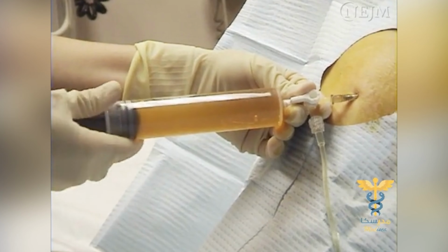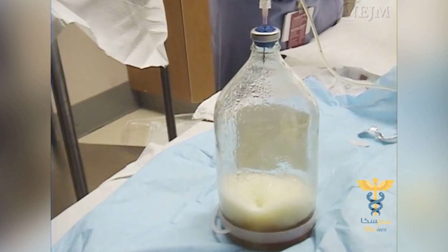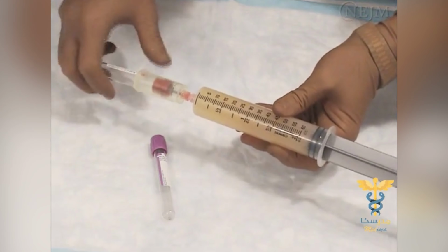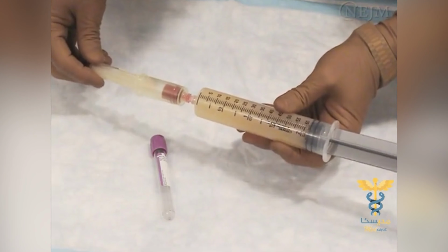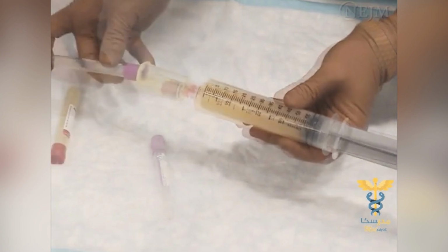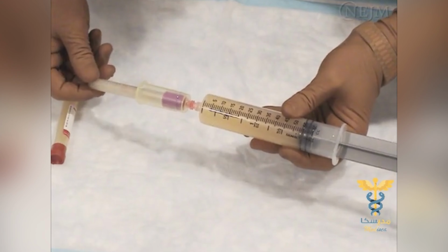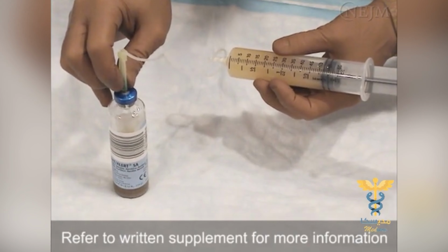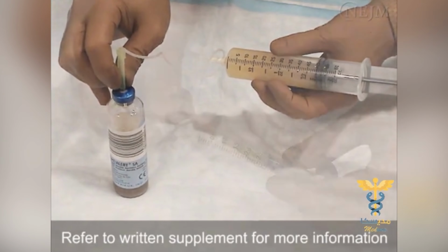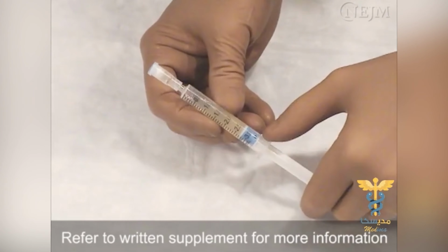Aspirated fluid should be placed in specimen tubes before the large evacuated container is filled or while it is filling. A tube without additives should be used for chemical analyses such as the measurement of lactic dehydrogenase, protein, and glucose levels. An EDTA-treated tube should be used for the cell count and differential count. Specimens for cytologic and microbiologic analyses and for other tests may be required depending on the clinical circumstances. These are discussed in further detail in the accompanying written supplement.